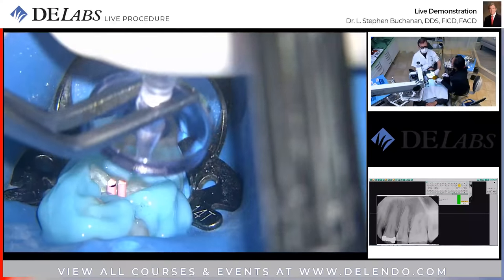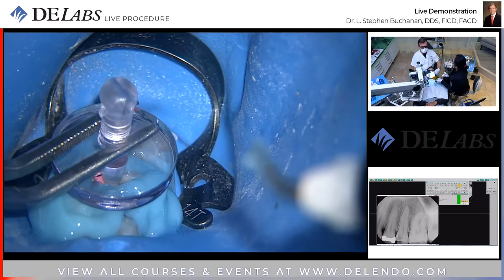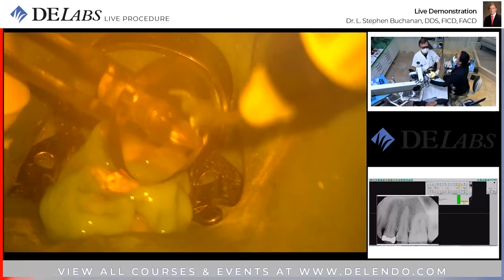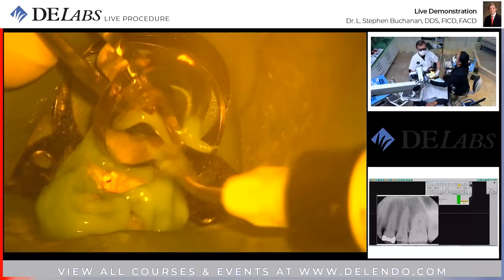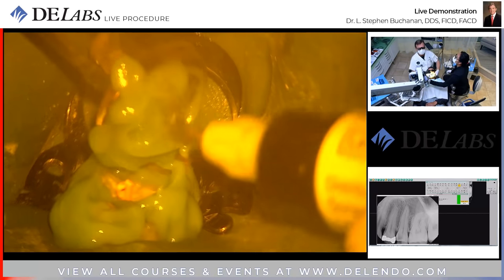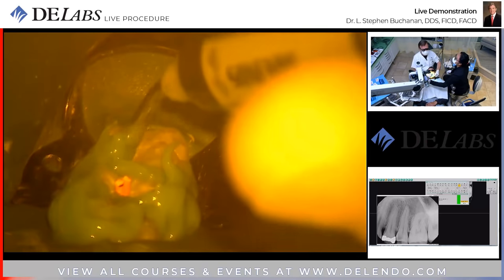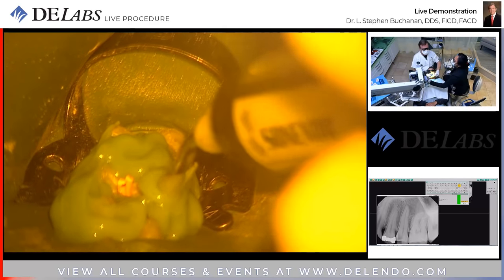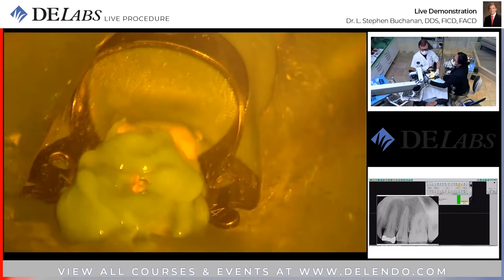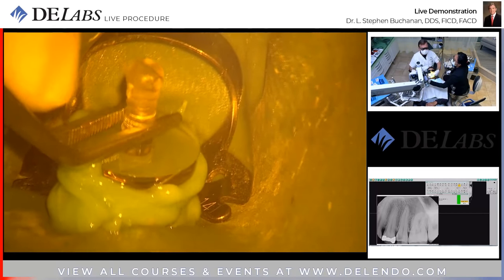I think I'm going to see if I can just leave them in there. I think it's going to be fine. Okay, so filter. A little tough to do it under the scope right here. Lots of goop. And usually, she was right in asking me about that. Usually, I want to have a sponge in, especially in molar access cavities.